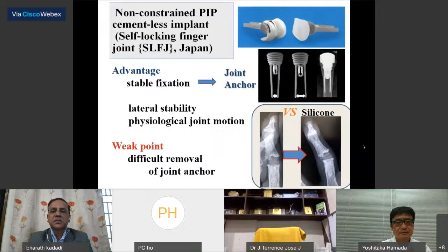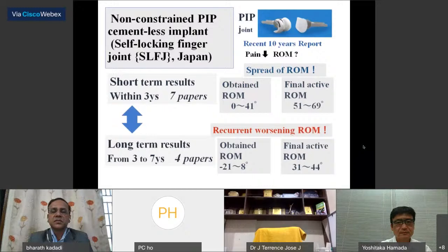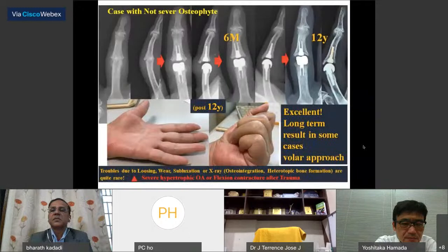The previous overall results are shown. Pain reduction was excellent. The short-term recovery of the affected PIP joint ROM was good, average 60 degrees. However, long-term ROM was reduced due to recurrent stiffness, resulting in contractures. Some cases, except severe hypertrophic OA or flexion contractures after trauma, show excellent long-term results over 10 years, as shown in this slide.